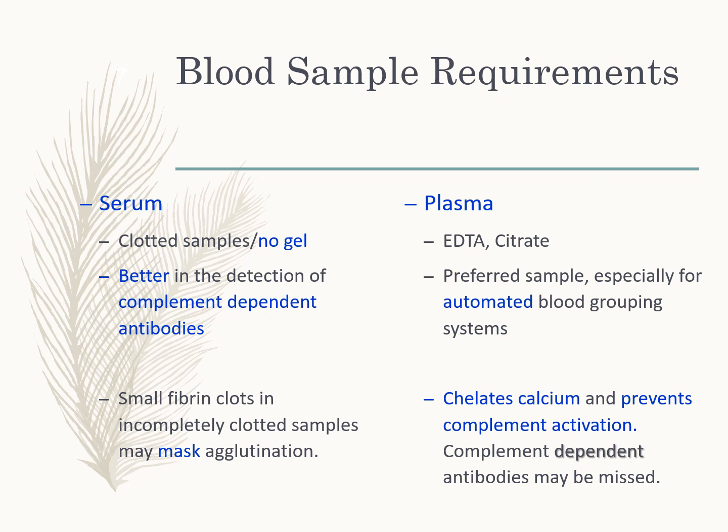In the past, most blood bank testing was performed on serum. Now it's really not used at all in the blood bank. Usually the blood bank will only get a pink or purple top EDTA tube. Usually we don't see serum at all in the blood bank. So each test will have a package insert that will say what samples are acceptable. Most manufacturers will only validate EDTA tubes. So you need to check if you do get a citrate or an ACD tube, that is plasma, but it may have not been validated for that test that you're running.